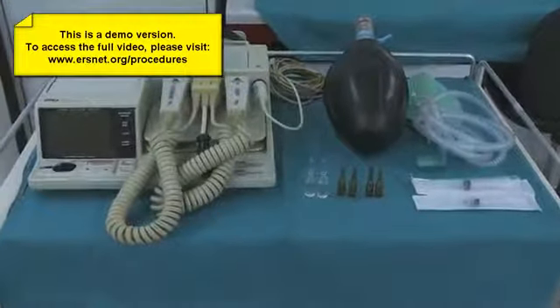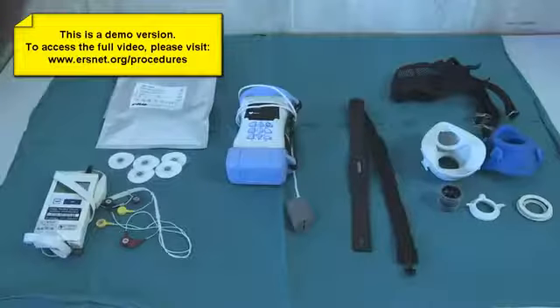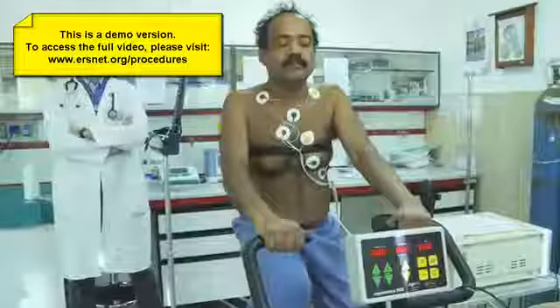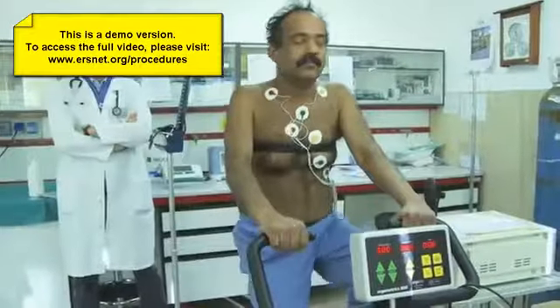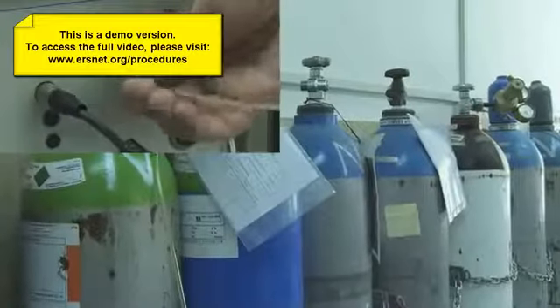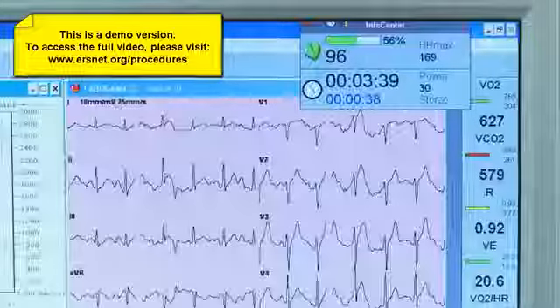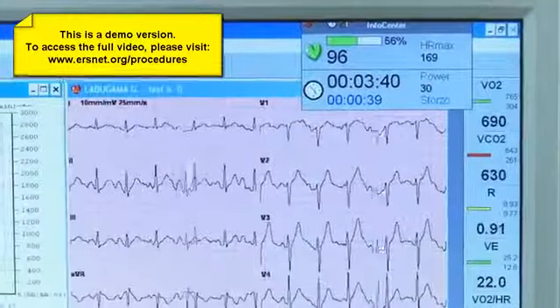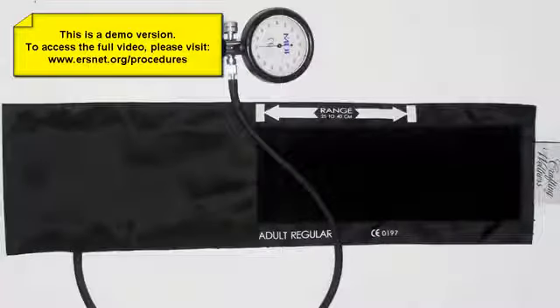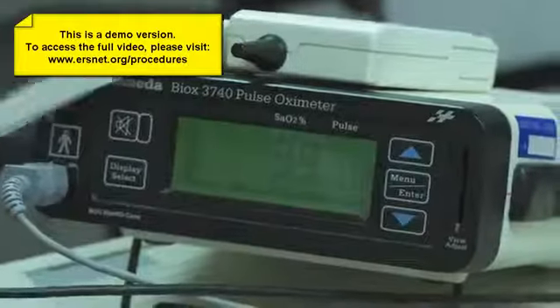A cardiac defibrillator must be in the room. The basic equipment utilized for CPET includes: an ergometer (a cycle or treadmill), a breath-by-breath pulmonary gas exchange system, an electrocardiograph, a blood pressure sphygmomanometer, and a pulse oximeter.